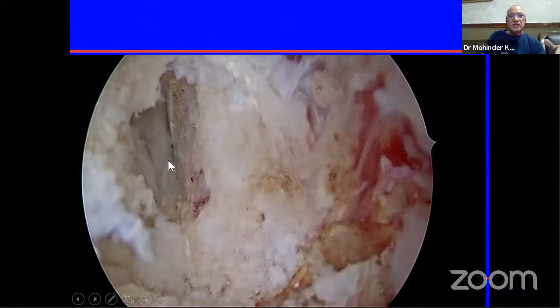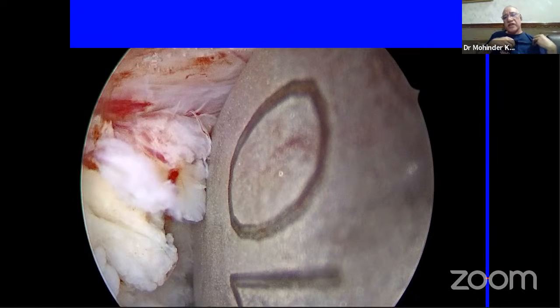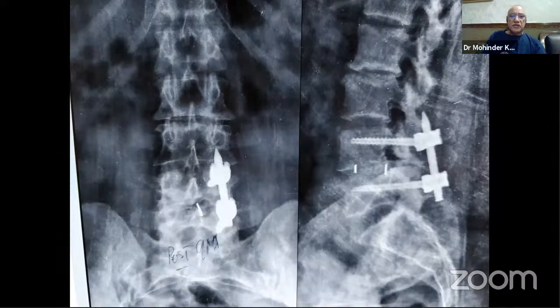And you can see how beautifully the scope goes in virtually. It is sitting over the end plate now. And you can see the inside view of the disc under fluid endoscopy. And this is a size 10 sizer going inside to decide which size of cage you have to put in. And these are the intraoperative steps. For low grade slips, I usually go in for a monolateral fixation only. And this is a patient with 9 months post-op follow-up doing extremely well.